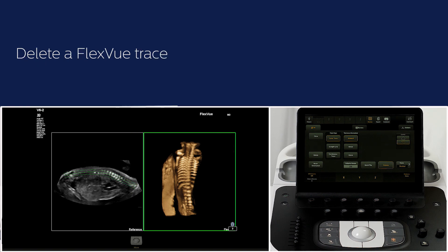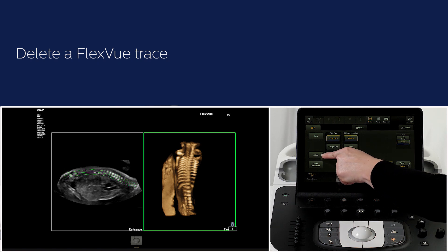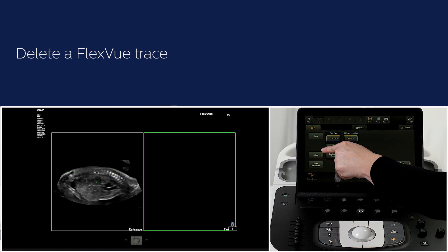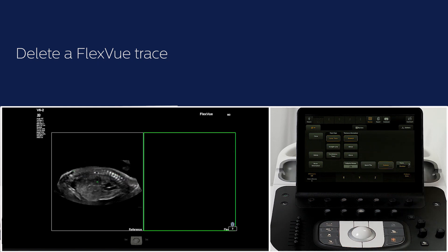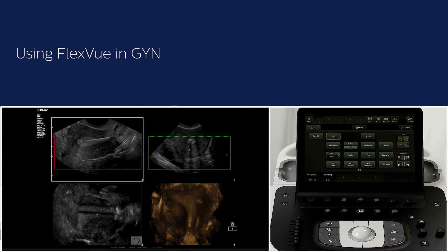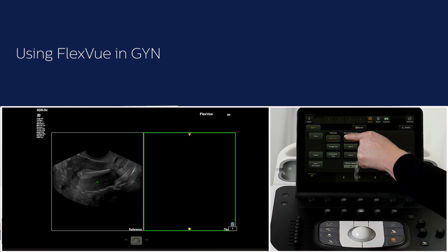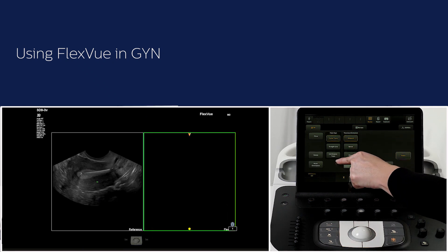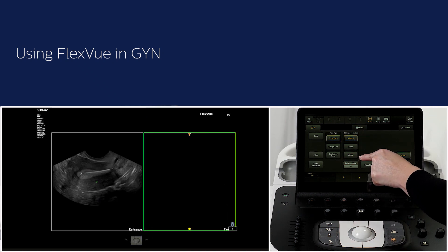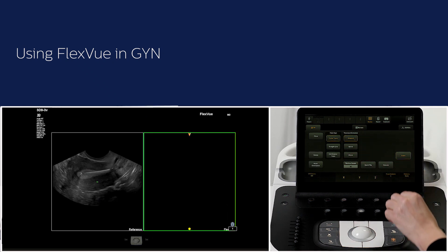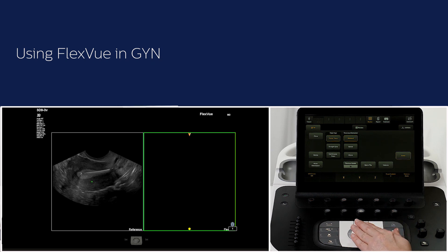If you want to delete a FlexView trace and start over, press delete on the touchscreen. I will now demonstrate FlexView using a Geini dataset. Activate FlexView, choose the trace type and thickness orientation, draw the line and adjust the position.